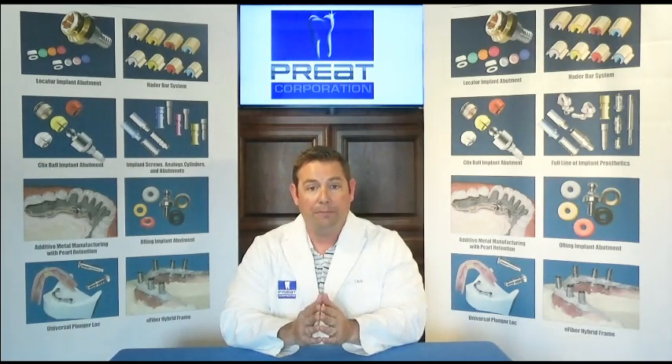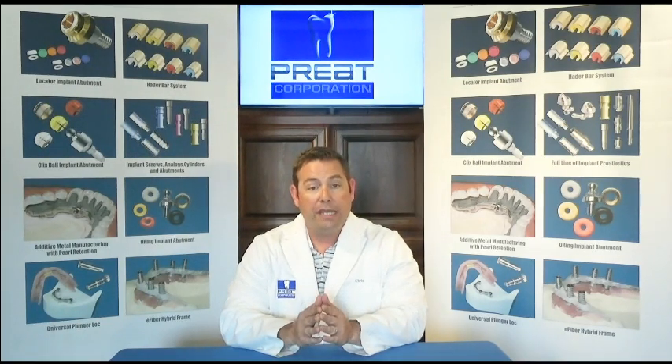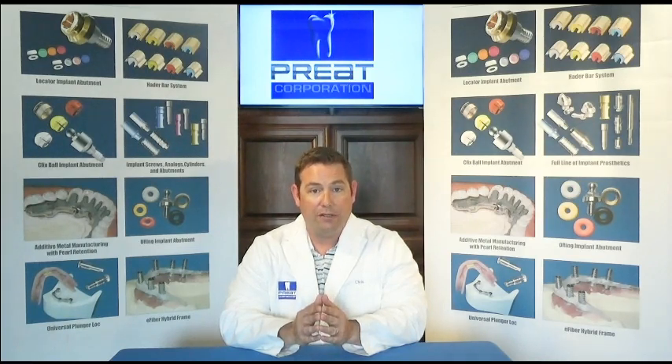So we're going to keep it really simple: no clips, no impression copings on the bar. We're going to block out the undercut and impress the bar itself. If we're using a stock tray or custom tray, that's all we need to do. If we're using the existing denture as our impression tray, we're going to leave the clips in the denture — we're not going to cut them out or cut out the housings. The vertical and bite are established, and we don't want to have to re-establish that.